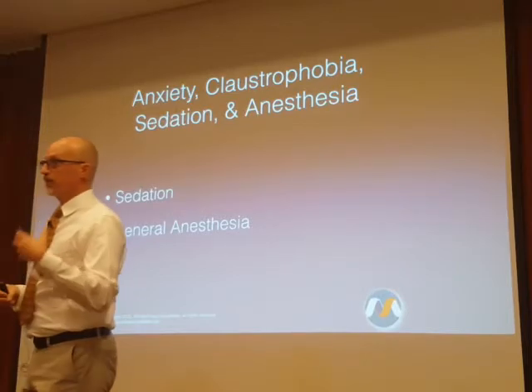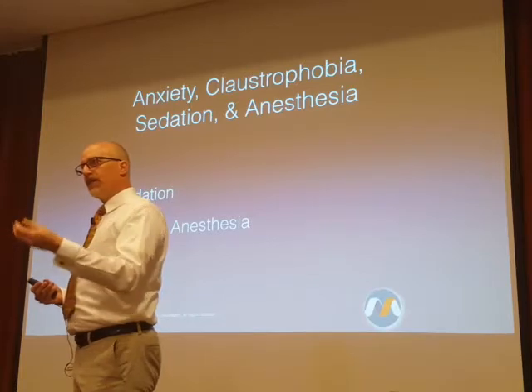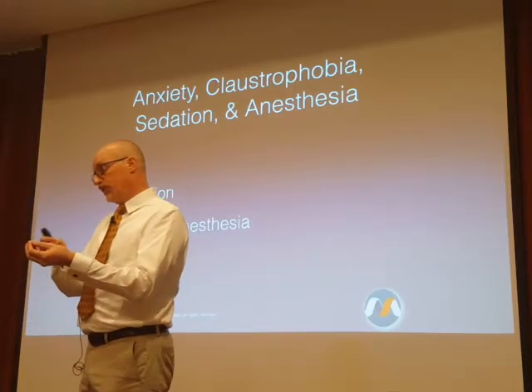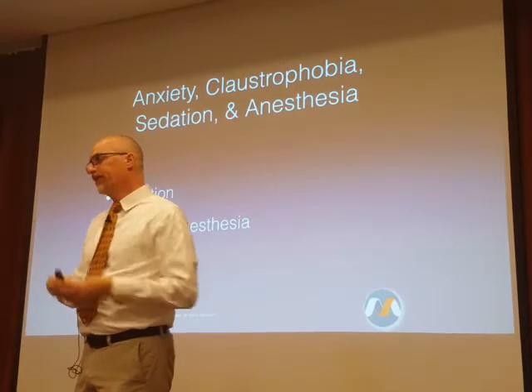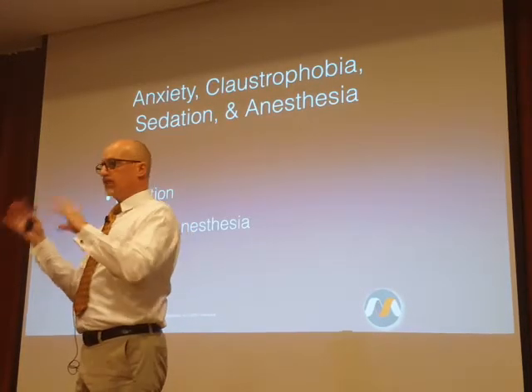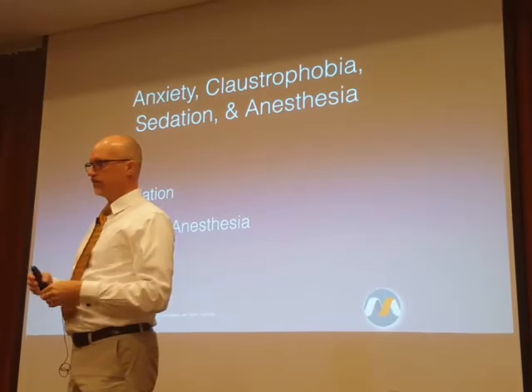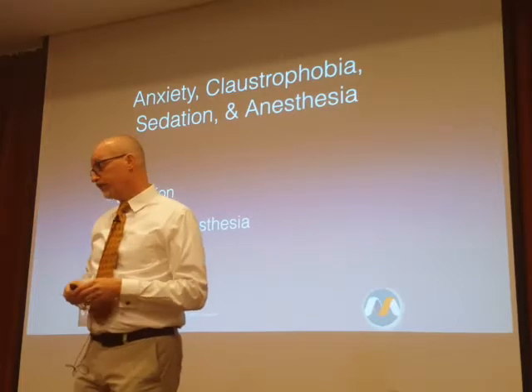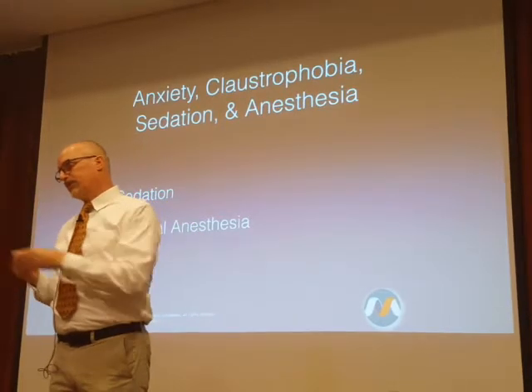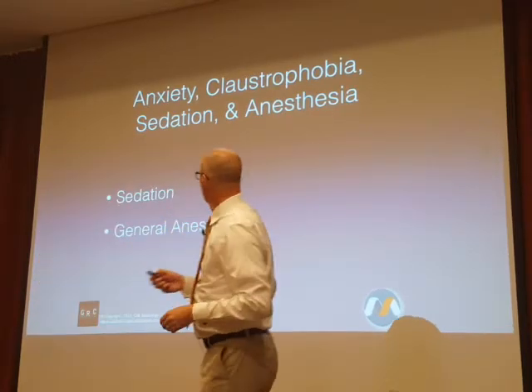Lots of hospitals, lots of facilities are planned without the expectation that anesthesia care is going to need to be delivered as a part of MRI. And so that becomes sort of an afterthought. Oh, how are we going to prepare the anesthesia patients? Well, we'll have to do it down the hall or on a different floor. And then things can get really complicated in terms of patient care.